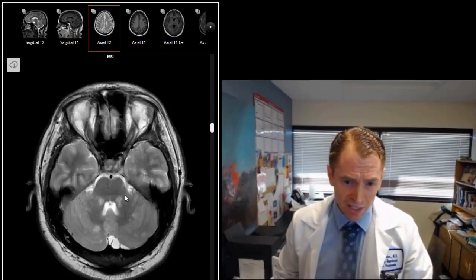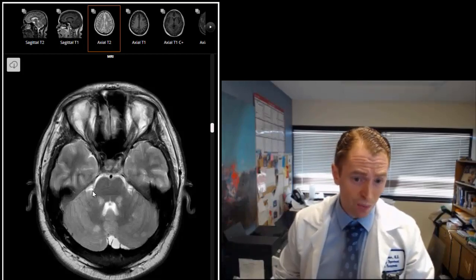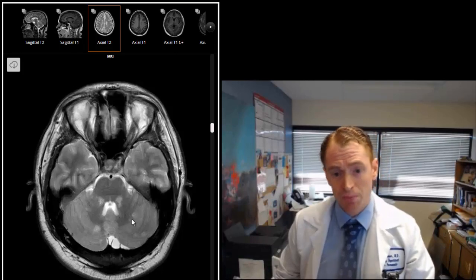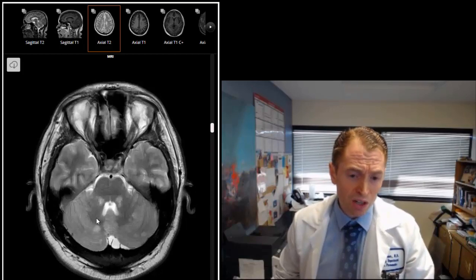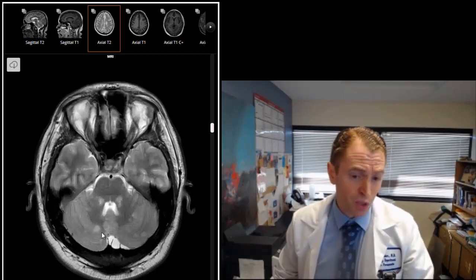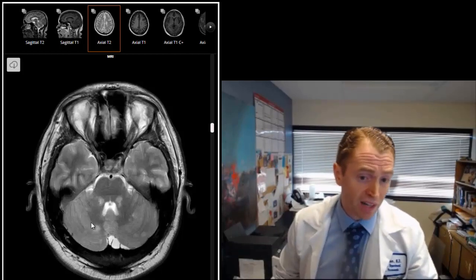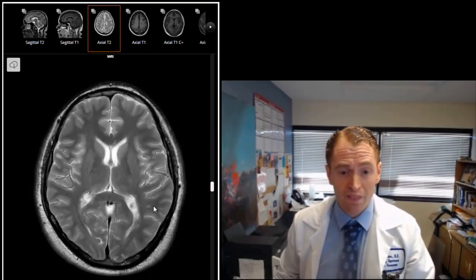You can see these lesions in the middle cerebellar peduncle. These could be associated with tremor and clumsiness. You can see all these spots in the cerebellum which could be related to imbalance. But the thing about multiple sclerosis is we may not be looking at permanent tissue damage. We could be looking at lesions that have demyelination and remyelination. So they're functioning fairly well despite that they look very abnormal on the MRI.